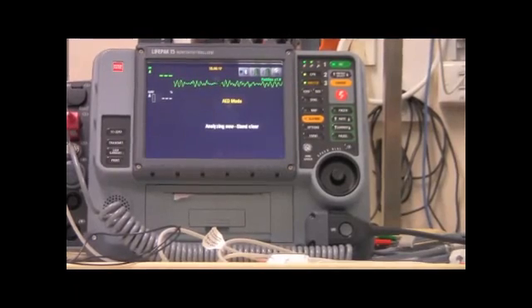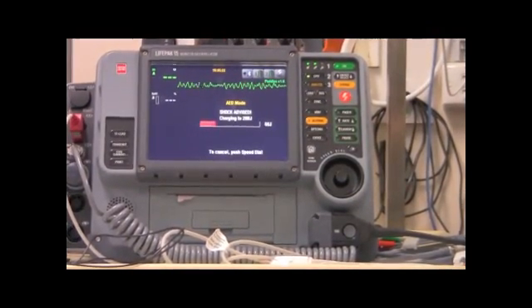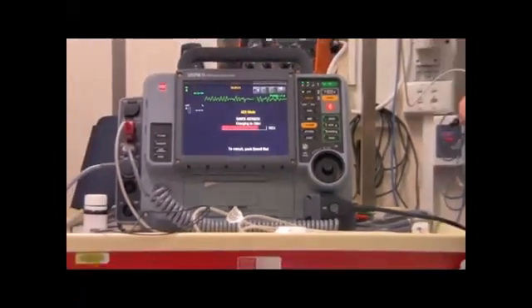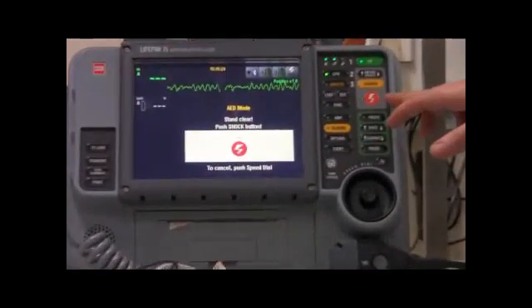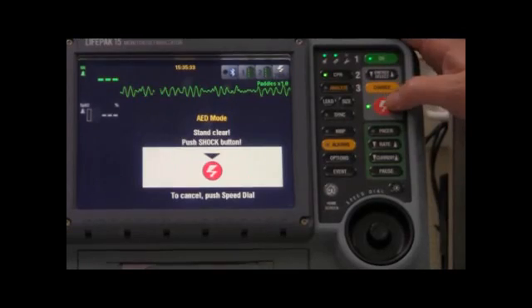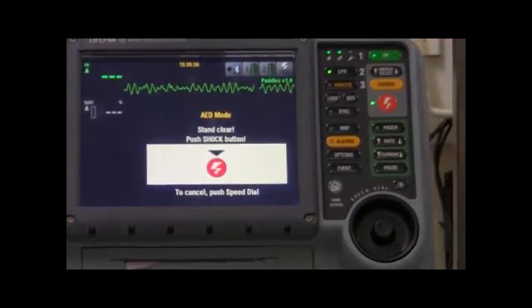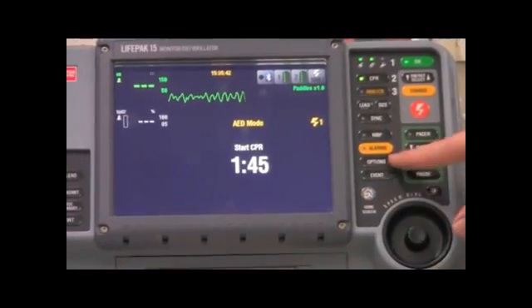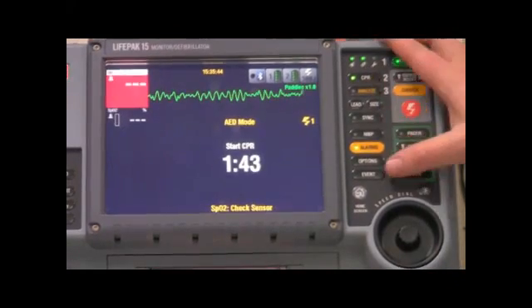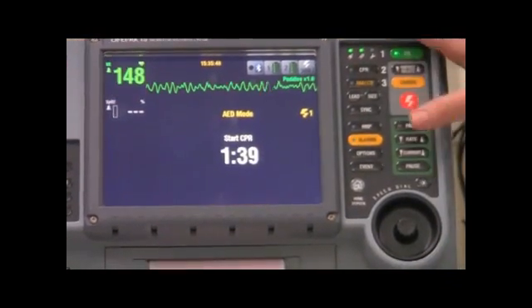Analysing now. Stand clear. Which it does for you. Shock advised. The machine automatically charges to the right amount of joules. Push shock button. And then it's just a matter of pushing the big orange button that says to shock the patient after you've done all your safety checks. And it produces a printout. Start CPR. So in semi-automated mode, it tells you exactly what to do, basically.